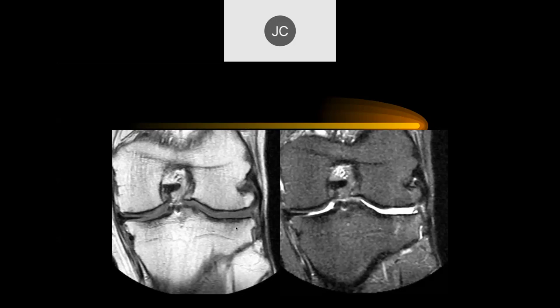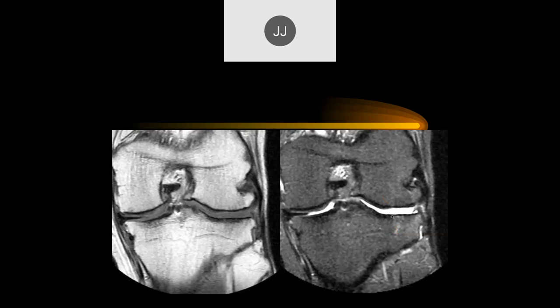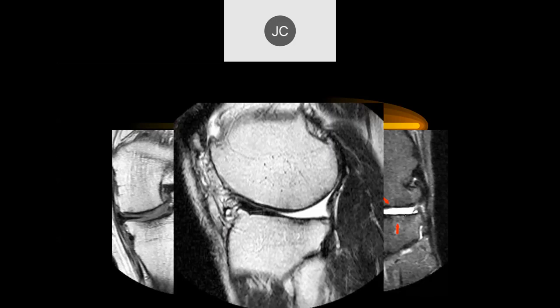Looking at the lateral compartment on the PD fat sat, there's full chondral loss, grade 4 chondromalacia, some subchondral edema. The meniscus is also absent — surgically, unfortunately. This was a patient where they did a near-total meniscectomy and depleted the articular cartilage by removing the abnormal cartilage. Debridement was a relatively common procedure for quite a number of years.